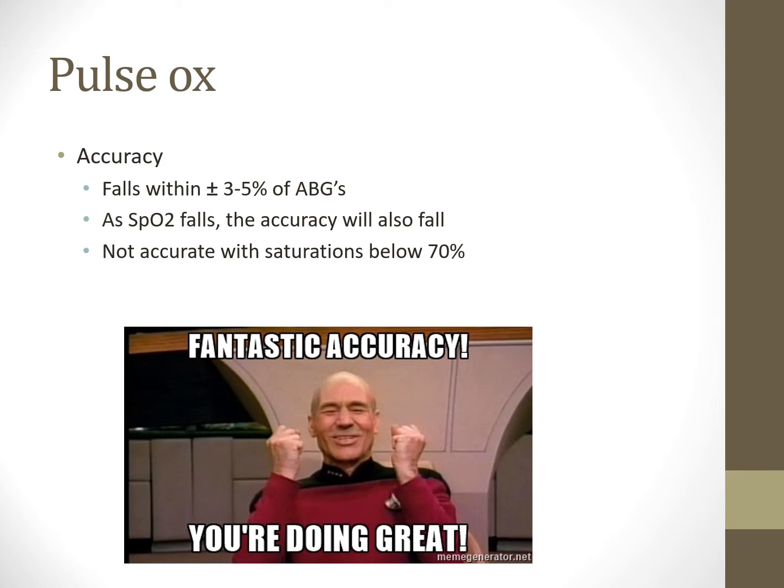You could chart that you've seen it there, but it is not considered accurate below 70% currently. So that's something to be aware of, because the limitation of the technology is such that as the saturation of hemoglobin decreases, the less accurate these devices are. That's just the technology limitation there. So the lower the saturation reading, the less likely the accuracy is correct.